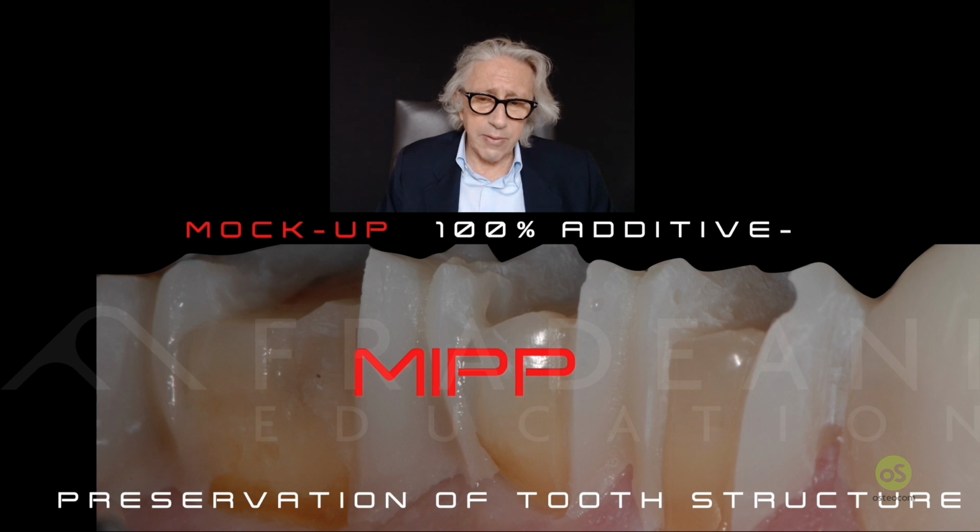It means when you increase the VDO, because you have lost a lot of volume of the teeth, to recreate a new occlusion, a new height, you will find a lot of space. In this case, you have a kind of preservation of tooth structure, incredibly, and you can do a mock-up that is 100% additive, and of course, once the mock-up is done, and we scan back, then you can have your final restoration, that is having 100% of additive solution on the remaining abutments. So we can refine preparation, but you cannot grind in the regular way.